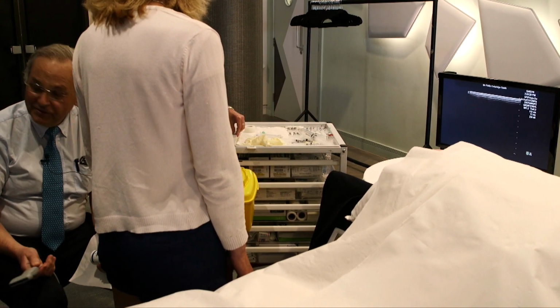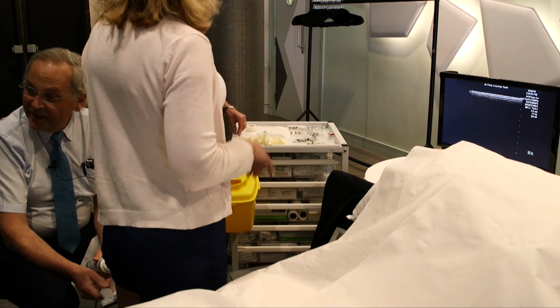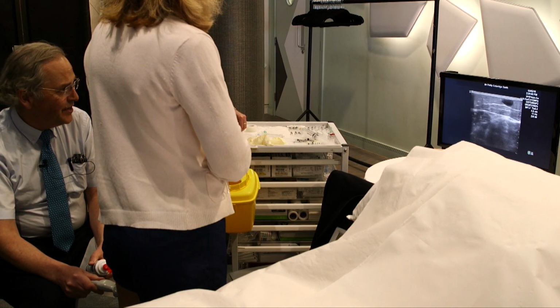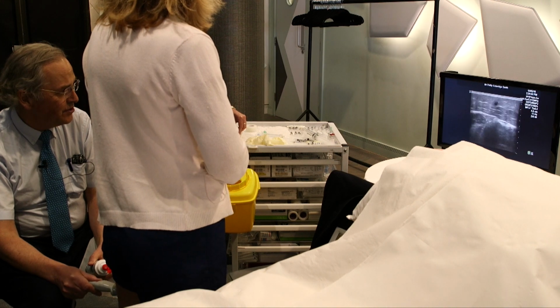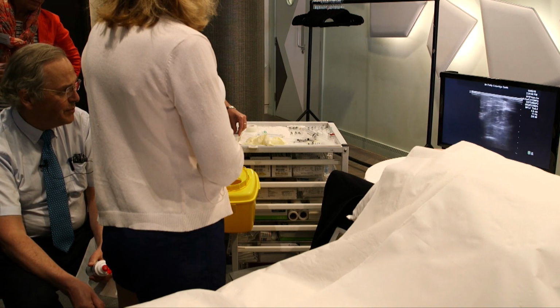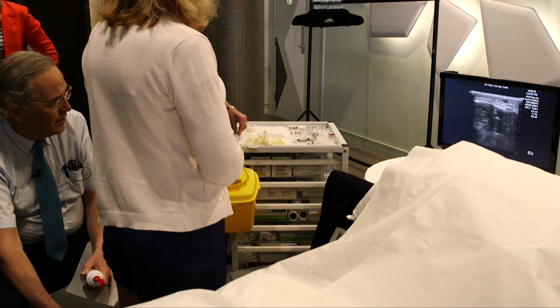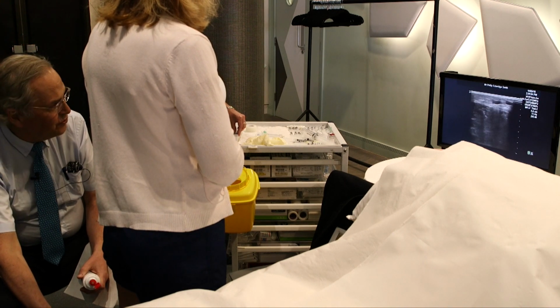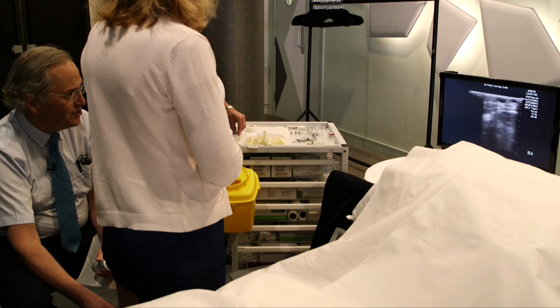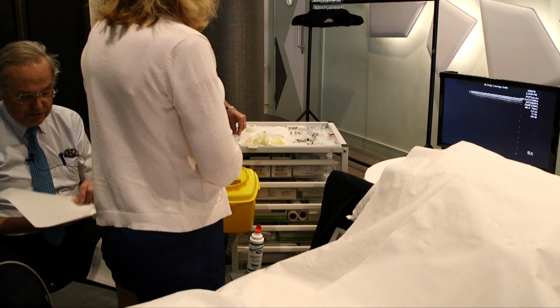So what I'm planning to do is to inject up here, and then hopefully with a cannula, I should be able to get a cannula in that. It's not the straightest vein in the world, but it should be okay to put a small cannula in. And then probably it would be possible to put a cannula in down here, but I think I might just directly inject foam into it, probably. If I can see a straightish bit, I'll put a cannula in down there. So that's one bit that we're planning to treat.